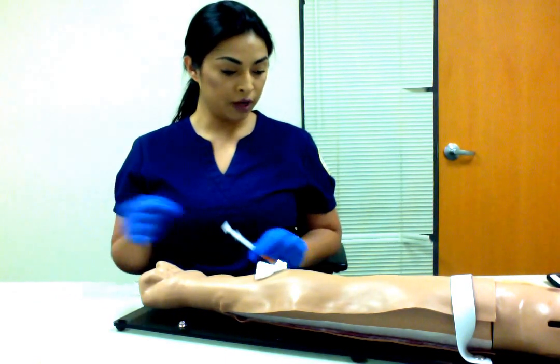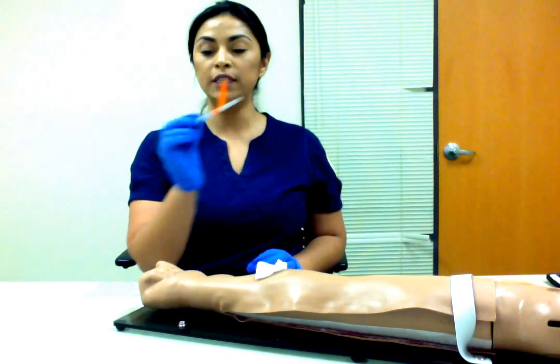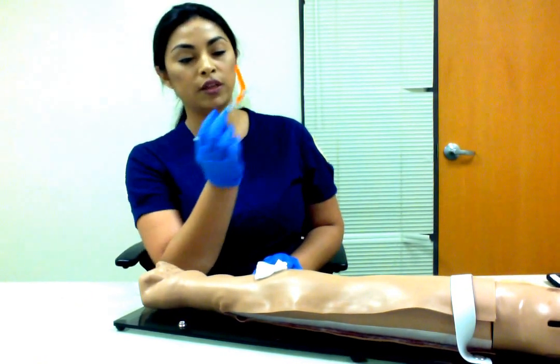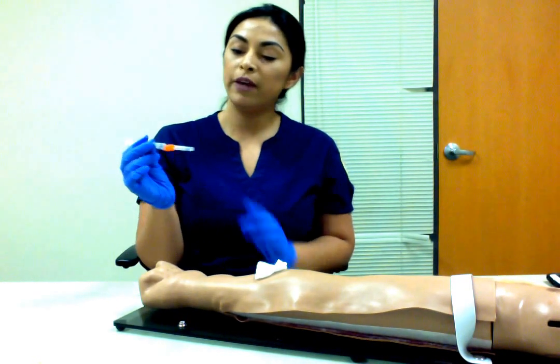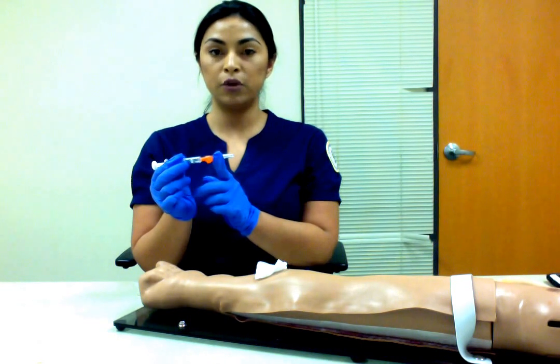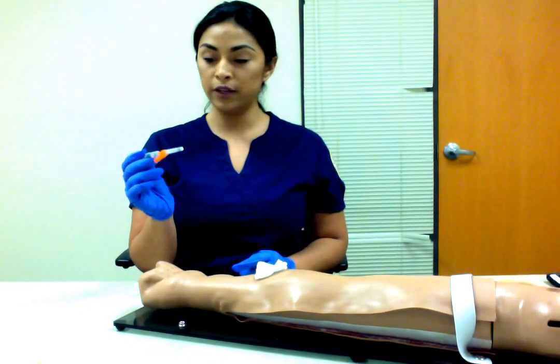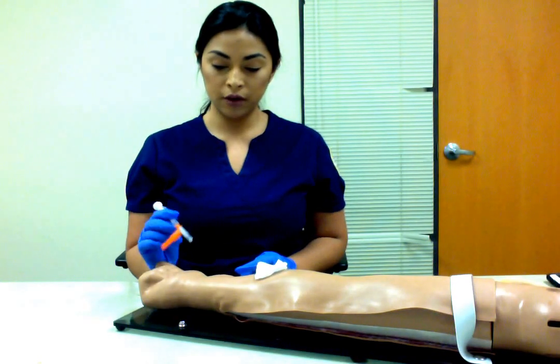Then you would get your heparinized needle. And you want 1 cc of blood, so you would make sure that it's at 1 cc. You would make sure the bevel is pointing up and that the cap is pointing away from you to not obstruct your view. You would go in within a 45-degree angle.